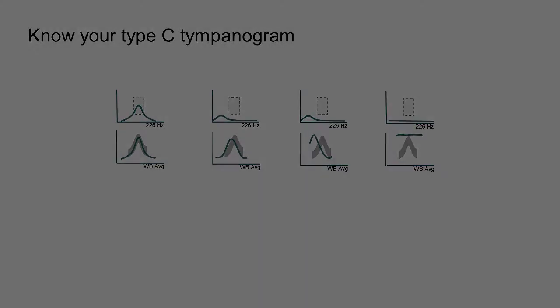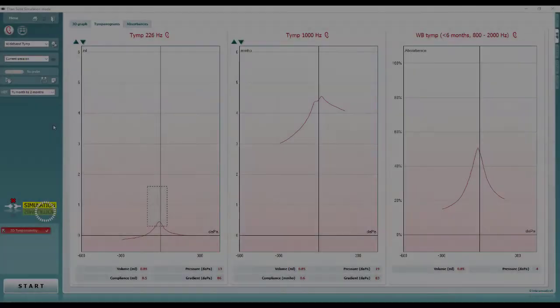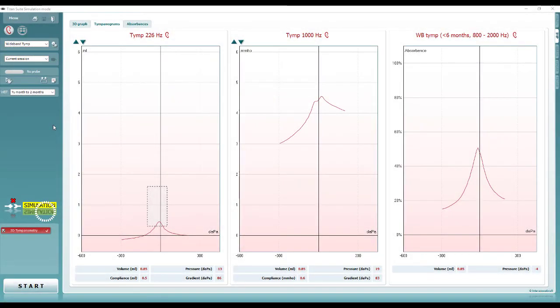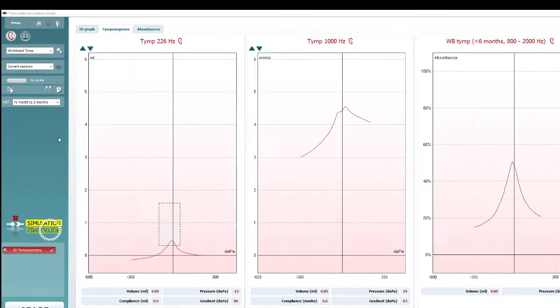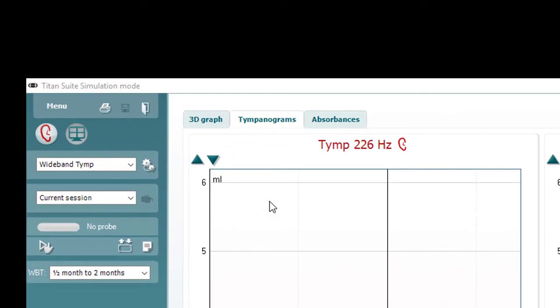There is still more data available from the wideband tympanometry measurement to help inform the diagnosis. The absorbance graph is next.